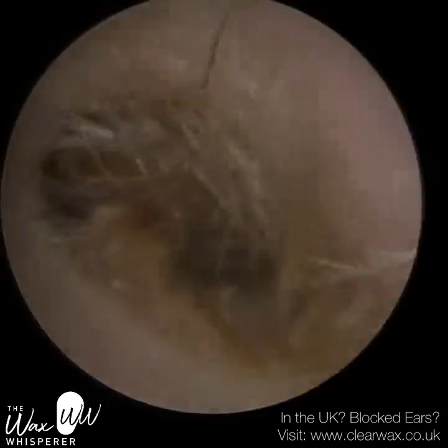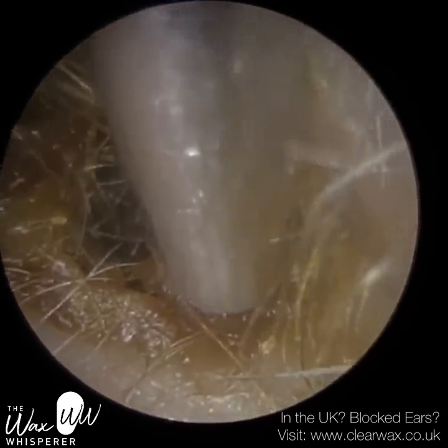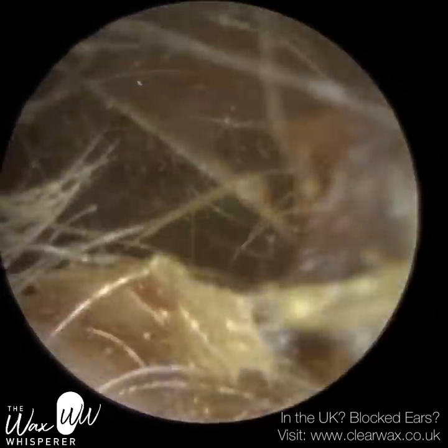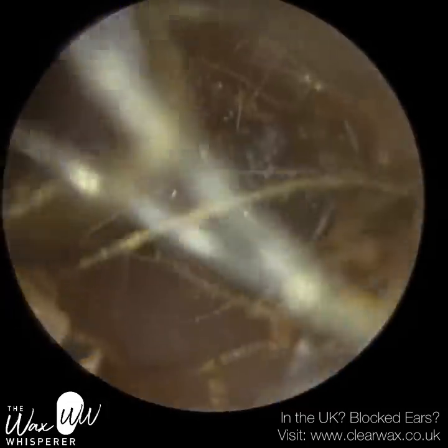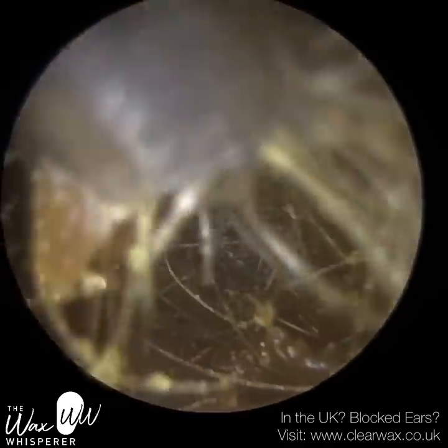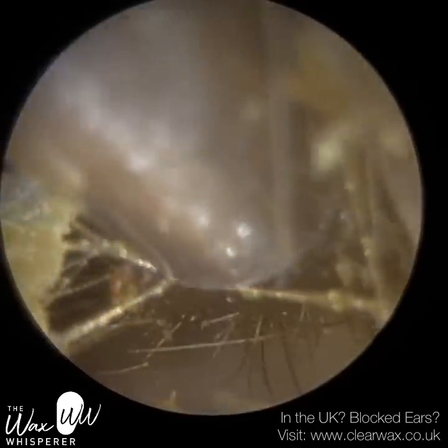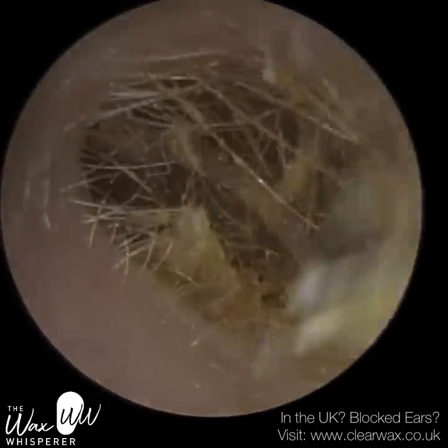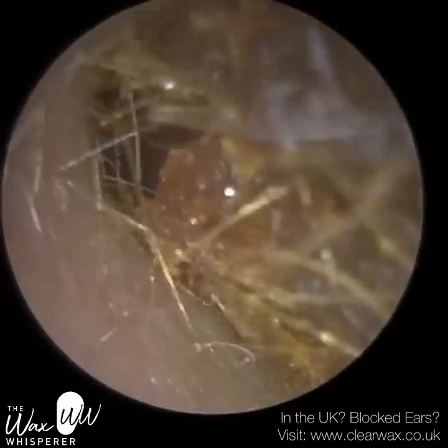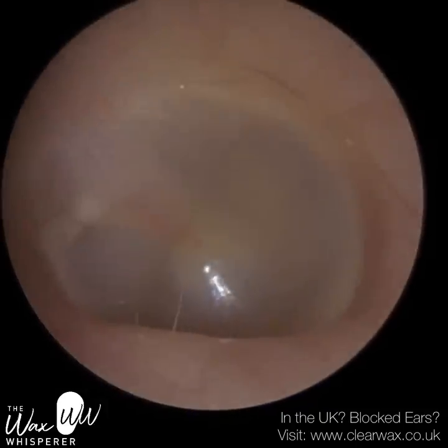This is patient two. Patient two had loads of hairs in the ears — it's almost like a forest of hairs. These hairs are unfortunately more common amongst the male species. As we age, men stop growing hairs at the back of the head, like the crown or temple region, but we seem to develop and grow hairs at a rapid rate inside our noses and ears. Would this amount of hair be a contributing factor towards this patient's buildup of wax? Possibly, because you can see the hairs are matted against the wax, almost forming like a spider's web at the entrance, which can trap the wax from coming out.